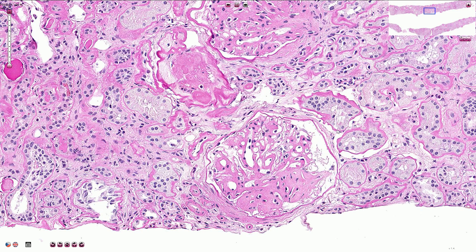Here we have the proximal tubules with slightly more voluminous epithelial cells with slightly granular cytoplasm. Here we have the distal tubules and here we have the renal corpuscles with glomeruli. This is the Bowman's capsule and the Bowman's space, which is not obliterated in this case.